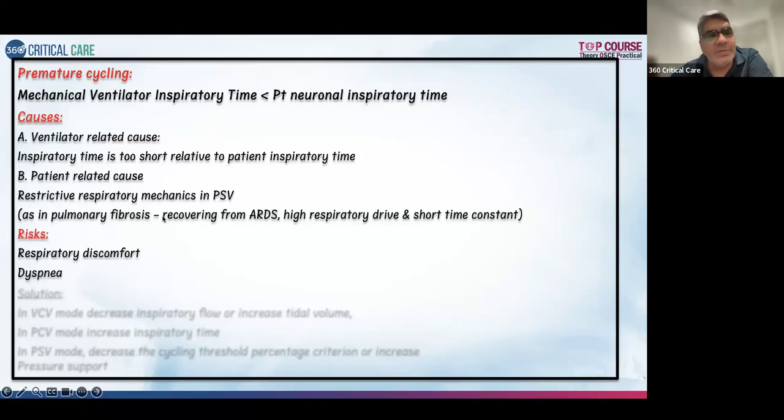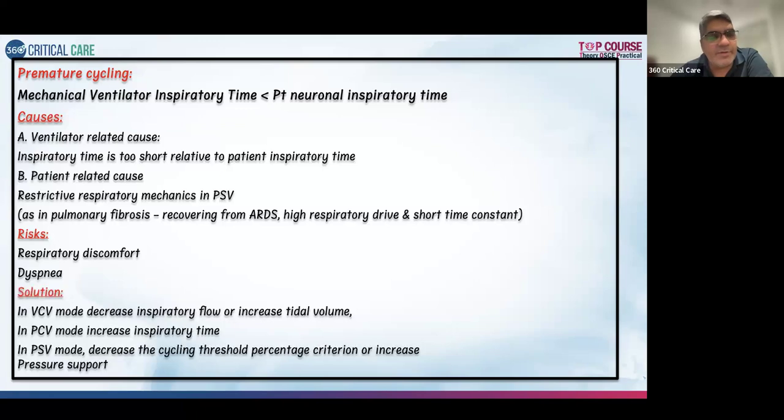What can this lead to? It can lead to dyspnea. Obvious dyspnea: you can see the patient has a high respiratory rate because of repeatedly cycling into expiration, and it can cause patient discomfort. So how do you manage it?